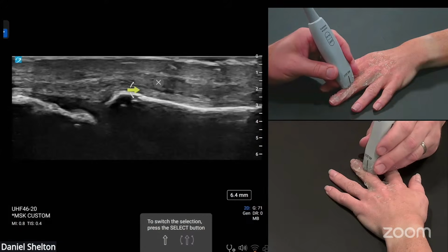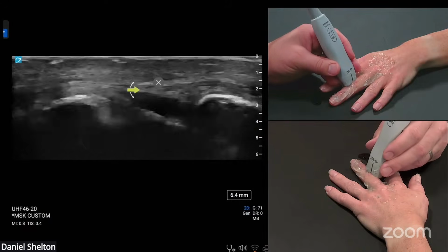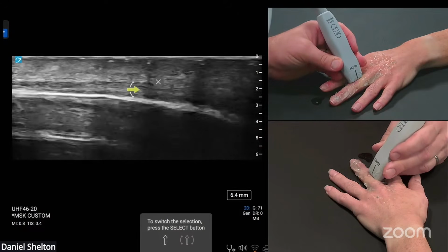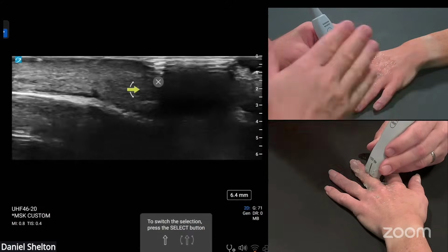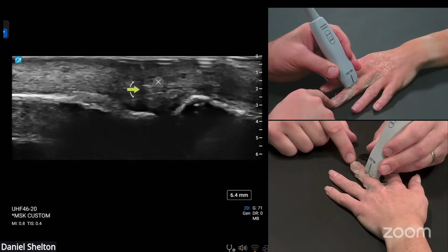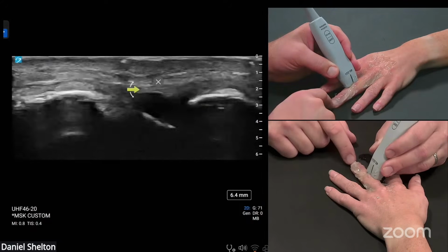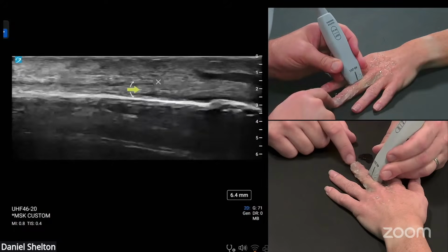So that's lumbrical, that's dorsal interossei, kind of combined to create that pathway for the extensor tendon to combine all those fibers. So you'll see a really strong tendon appearance in long axis here, even though I'm on the side of the knuckle. And you can confirm that it goes all the way to the tip just by moving the DIP. So I'm just pushing the DIP down, and I can trace which tendon I'm following. And you'll just have much better luck going down the side walls of these fingers, not dorsally.